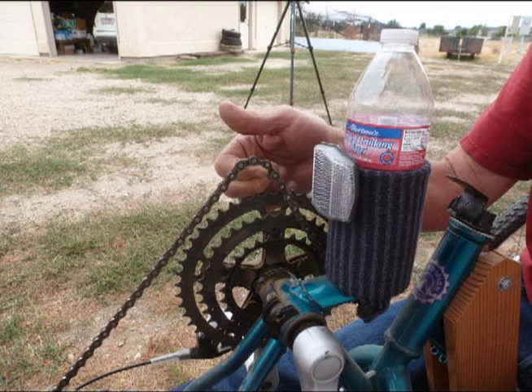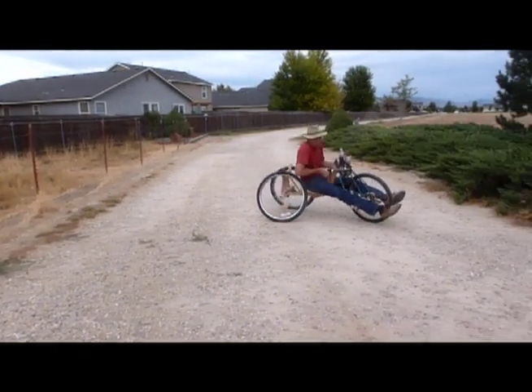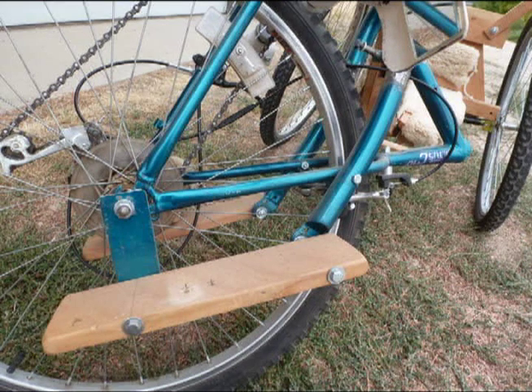You can easily utilize all 21 gears to match your riding style and environment. The short turning radius works well on narrow paths and roads. You can add a customized seating system to meet your specific needs to the flat seat and leg support platforms.